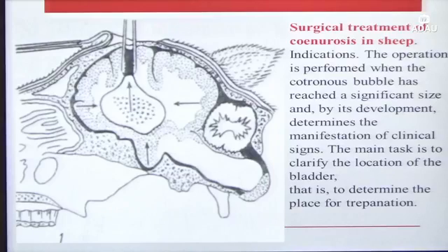We should know the trepanation places, and with a Couture's trepan, with burrs, we should remove this capsule. But we should remove the capsule entire and not damage it, because some helminths may stay and develop there. This is a coenurosis bladder. After removing the bladder, after 1 or 2 weeks, I think this operation gives a good result.